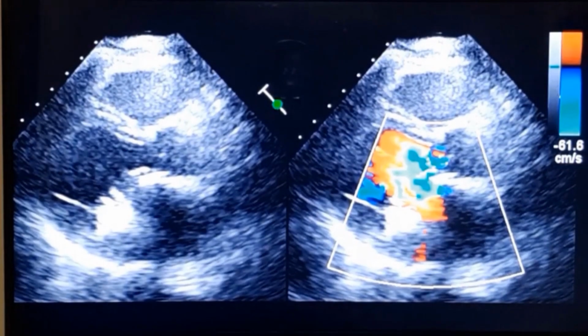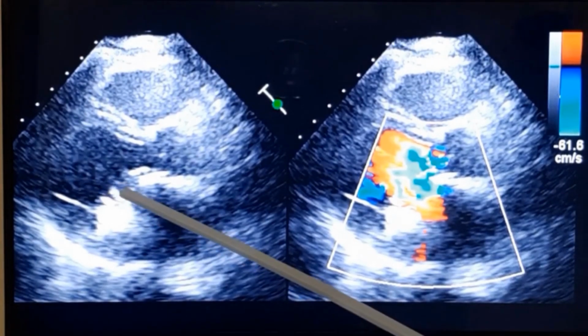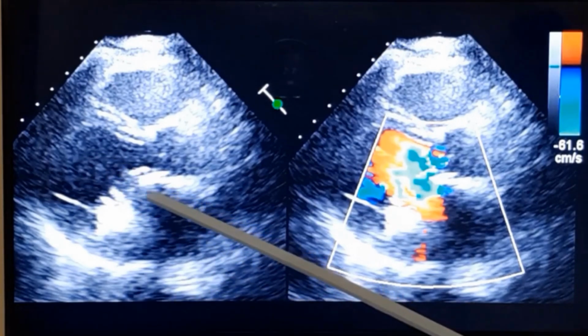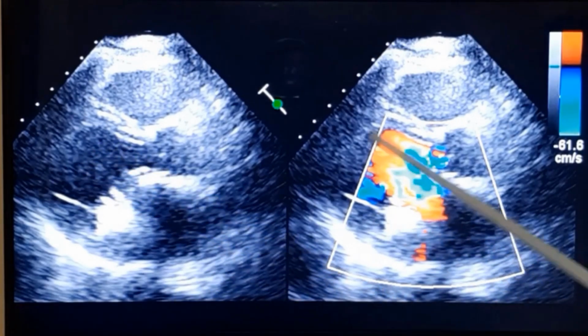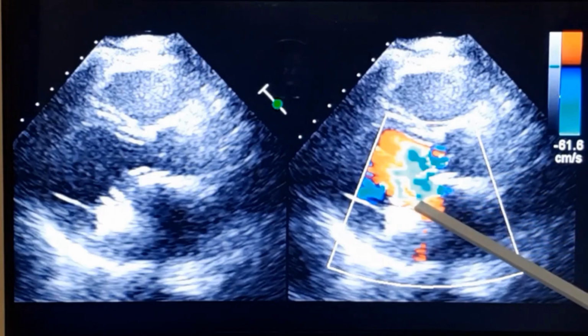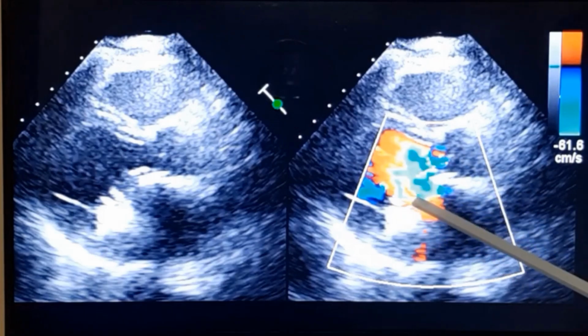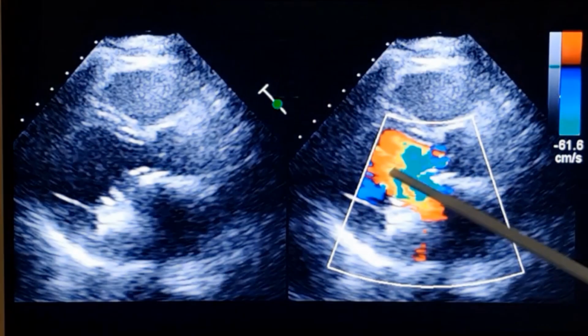This is in a position where the valve leaflet has opened a little more. This is full opening. You can see the mitral leaflet is opening better, and this is the direction of flow. And you can see it is turbulent, mosaic color. Mosaic color means there is turbulence and change in velocity is occurring. This is the maximum of the Nyquist limit, and if it's beyond that, there will be a wraparound in velocity, color wraparound, and color changes from red to blue.